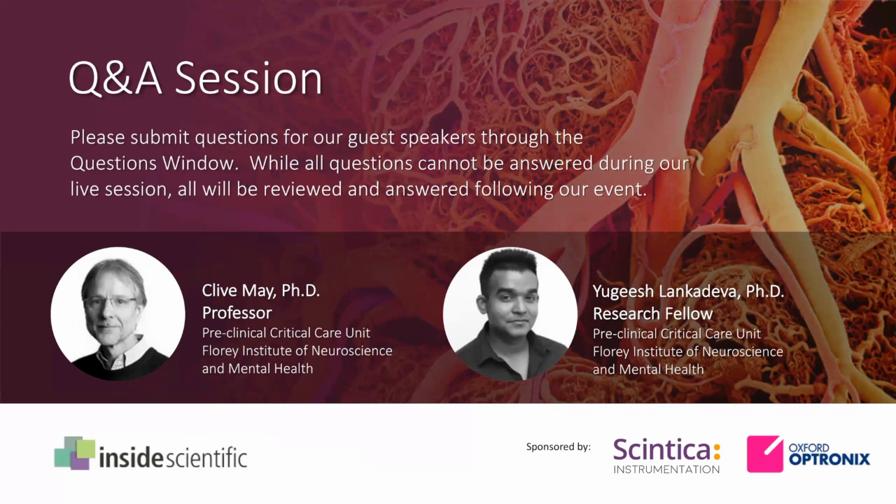First, I'll just say that we've had probes implanted for 3 weeks, I think is the maximum, and we've been able to continuously obtain measurements over that period of time. Over that period of time, the measurements are stable, again suggesting that the calibration is stable and that we're getting believable and useful measurements. We take our probes out, usually after a week, which is the length of our normal experiment, and generally we can reuse them again. Occasionally we can reuse them a third time, but in general I'd say we use them twice, for 2 one-week periods.